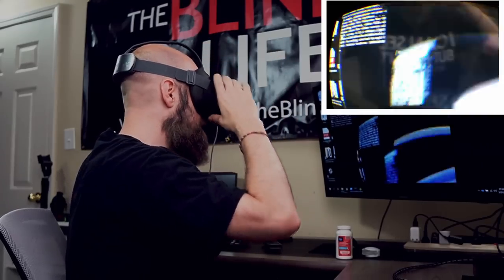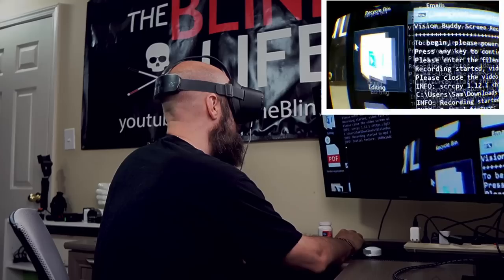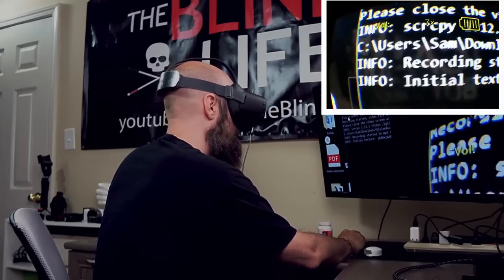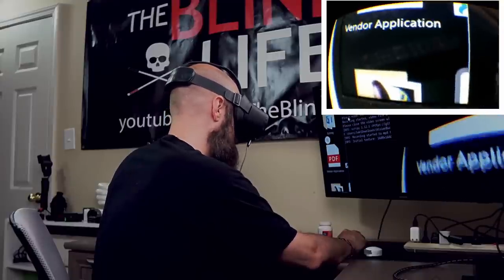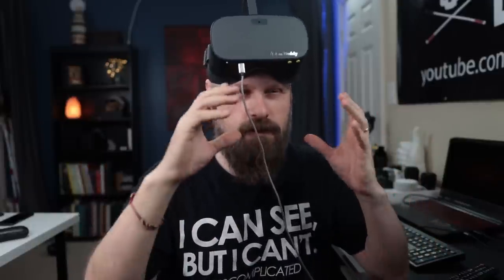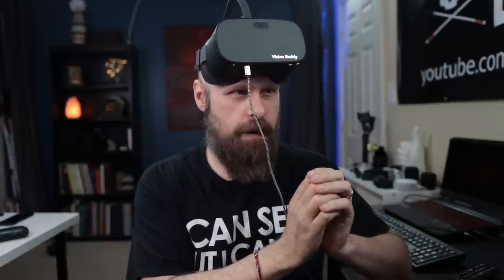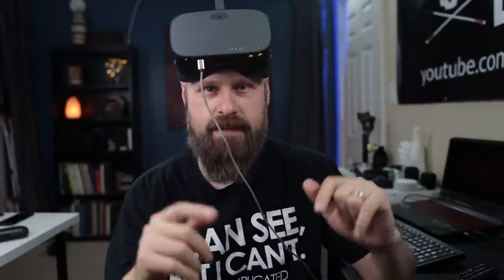Some people always ask about reading a computer screen. I can zoom in on the computer — that's the program running the screen recorder. It works pretty well; I would probably be able to use the computer like this. Just like any digital video magnification, you're zoomed in so much that you're only looking at a small section of the screen at a time, so you'll need to move your head around a lot — but it's doable.